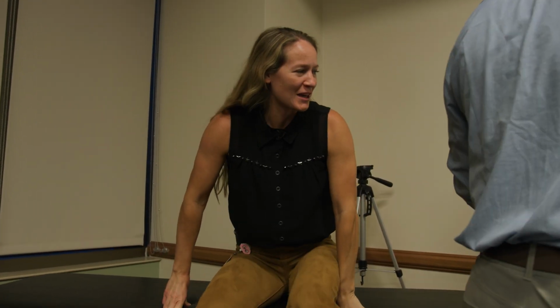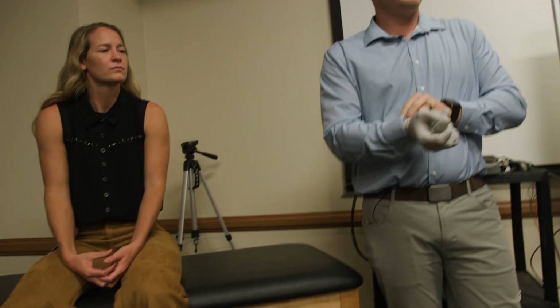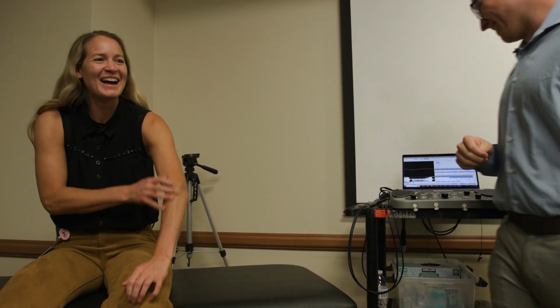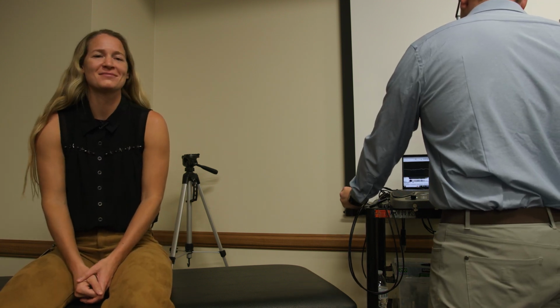Honestly, if he didn't tell me that there were needles, I wouldn't have known. Those were tiny. You can't really feel that it was a needle. So that didn't hurt at all, or feel uncomfortable even. Yeah, so especially in larger muscles, like you said, sometimes you don't even know that the needle has been placed. Yeah. There are some more tender ones if we have to check out some in the hand or the foot. You feel them a little more, but that would be as bad as that gets. Anything else you want to tell us about your experience? Probably a little bit more weird when it's done in front of a room of people. But beyond that, it really didn't hurt, wasn't uncomfortable. So reassuring for patients.